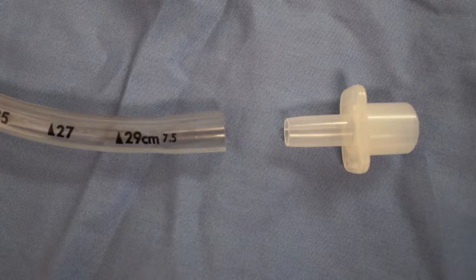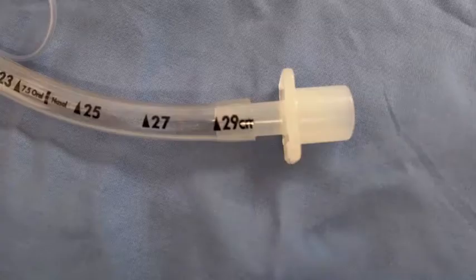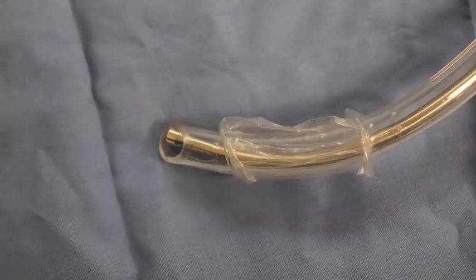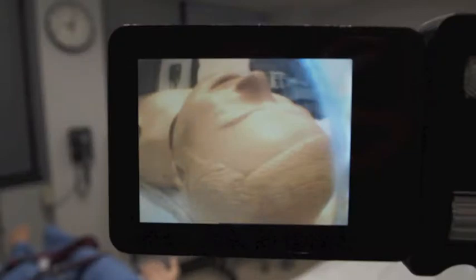Simply remove the top of the endotracheal tube, trim the ET tube back to the appropriate length, typically just beyond 29 centimeters, and then replace the top of the endotracheal tube and slide it onto the stylet. Now check position, and it's noted that the stylet is not protruding but is at the end of the endotracheal tube, allowing for a view as shown.